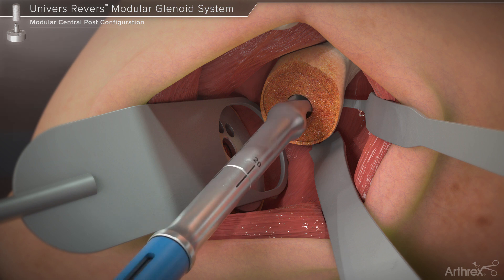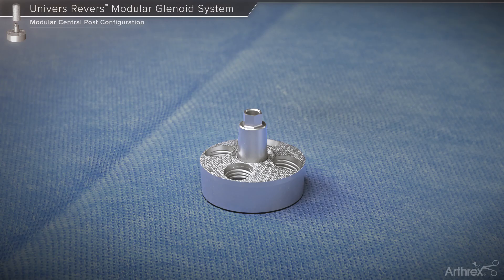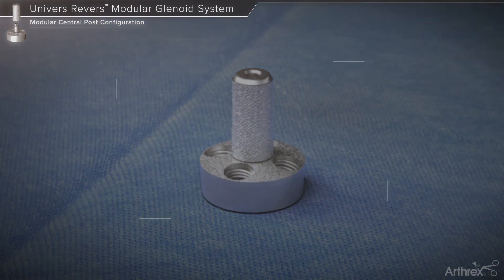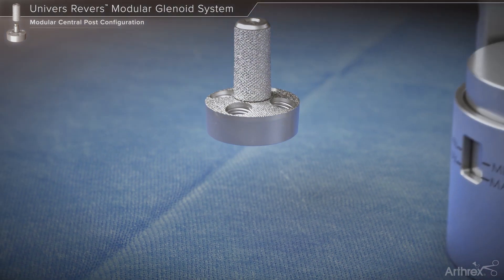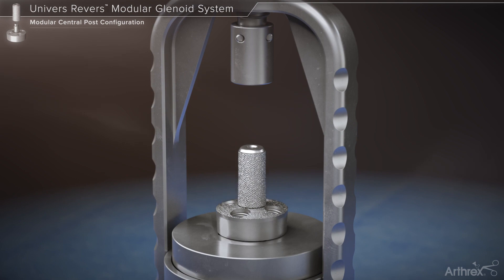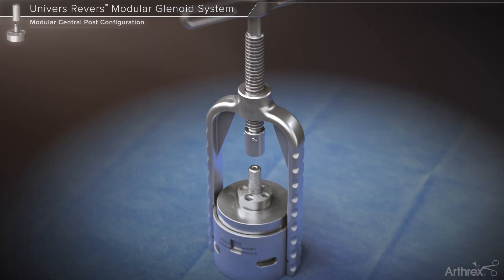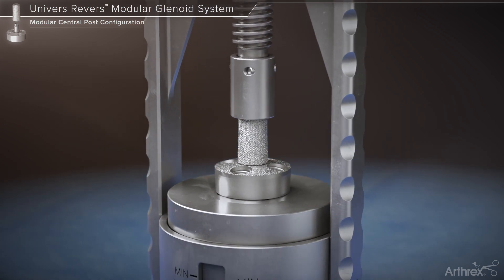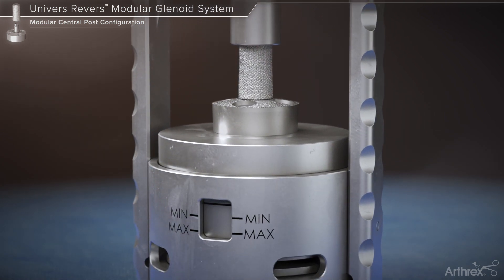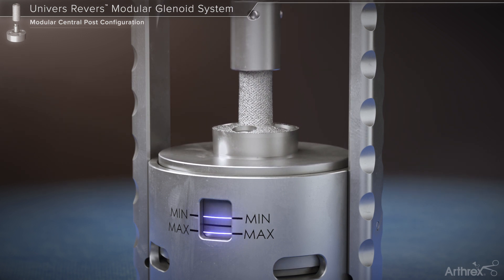The drill is advanced until its collar is flush with the glenoid face. On the back table, the selected base plate and central post are joined, gently placing the central post onto the base plate taper. The base plate assembly is placed into the base plate taper assembly press. The handle of the press is then rotated until the laser line within the window of the press indicates that sufficient force has been applied to couple the base plate components.